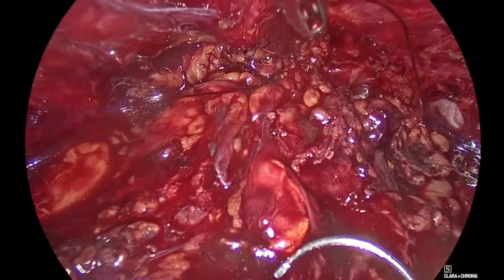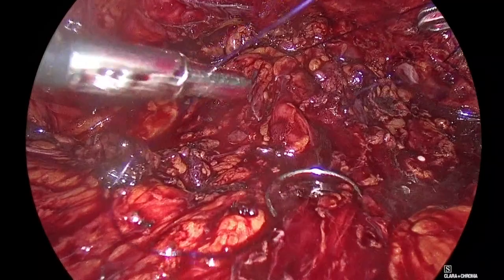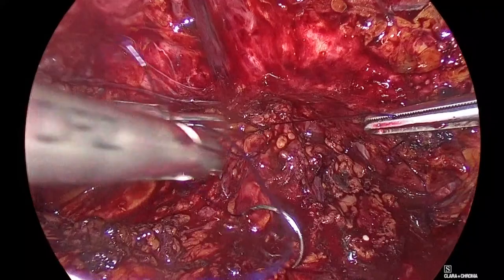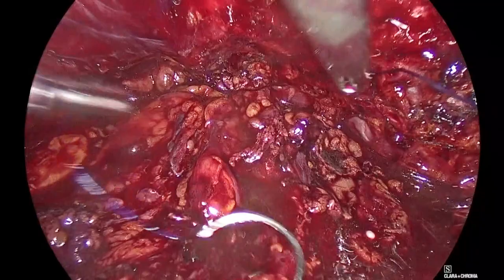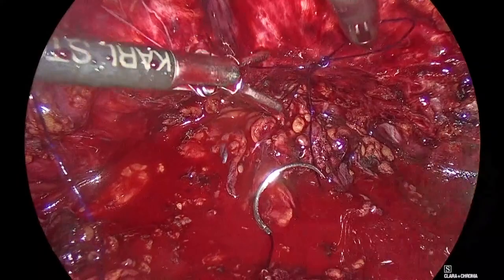I think the only observation I've had is that without a drain, the patient has less discomfort, so they tend to go home. You take the drain out in the evening, the same evening. Go back. There are surgeons who say that most of the time, you don't see the bleeding from the drain, but if the drain is passive on the floor, you suspect it. You see something. For example, look now, we have this red thing here, which I need to see where it comes from.